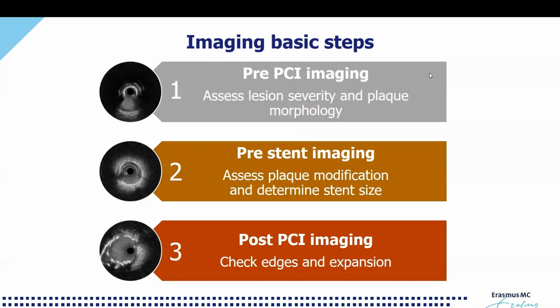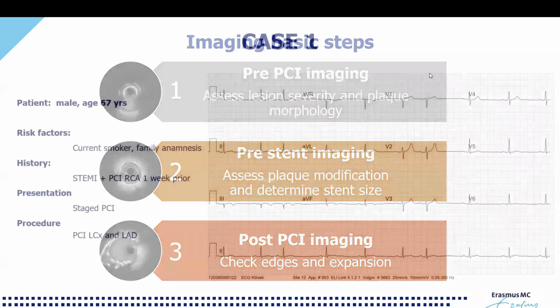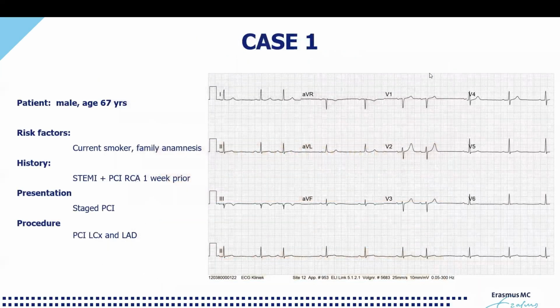Then I think it's going to the first case. And in this case, Rakesh, we have to switch to my laptop, because there I have the parts in DICOM. We're going to show you a couple of cases with the real system of ACIST, the simulator of that, but we couldn't get all the cases in this simulator, which has this limitation.